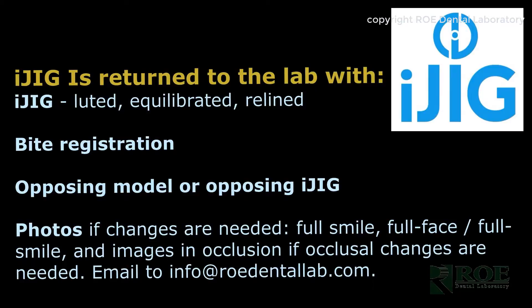It is important that all the steps are carefully followed. When the iJIG is returned, on the work authorization, please order a printed try-in, or in some cases, if the iJIG was very, very close to the final, you can order the final restoration. Thank you very much for watching this video.